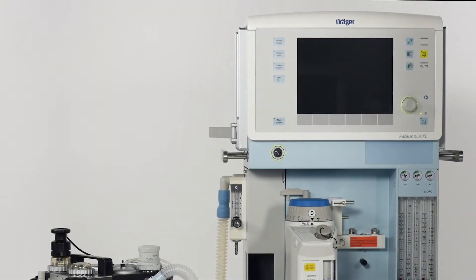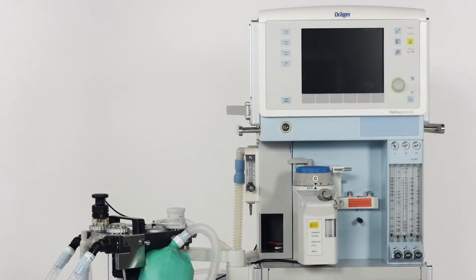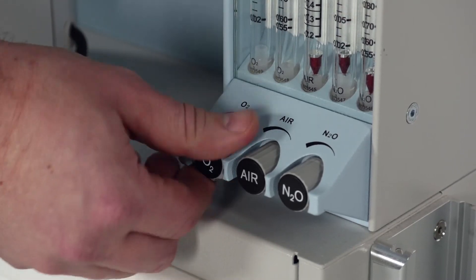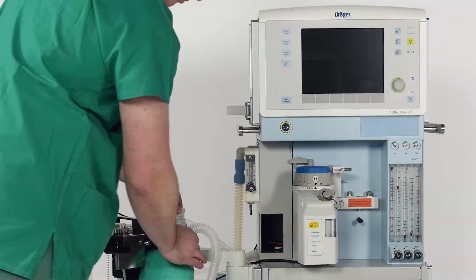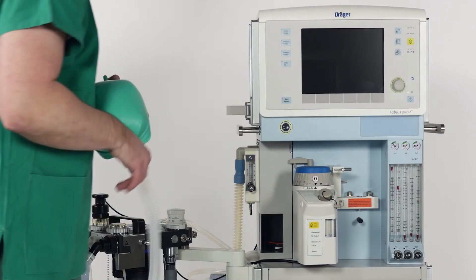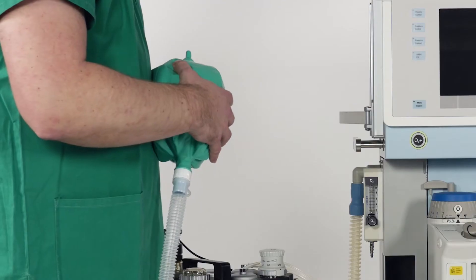In this segment we'd like to explain the device behavior in case of an emergency startup. If the device is switched off and you need immediate access to ventilation, the only thing you need to do is to turn on the oxygen flow. The fresh gas is now channeled through the breathing system and you can manually ventilate the patient using the APL valve and the breathing bag.